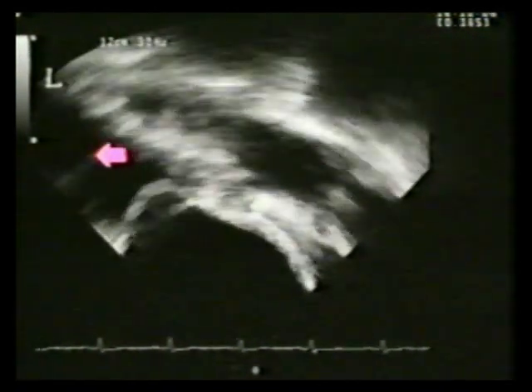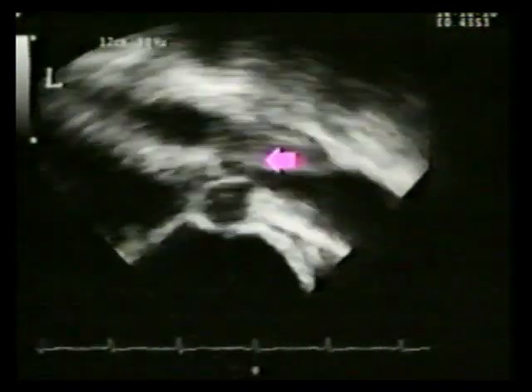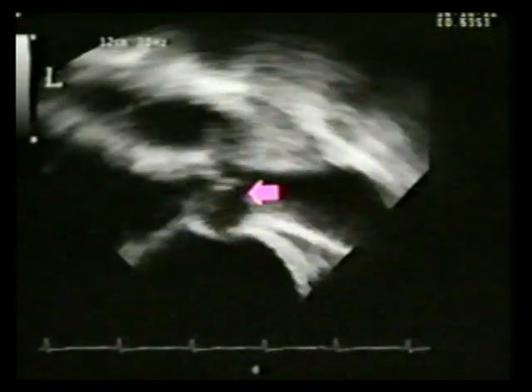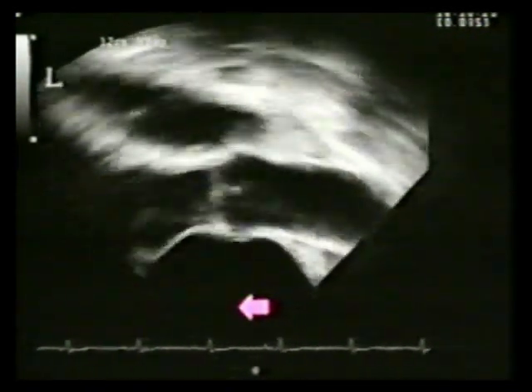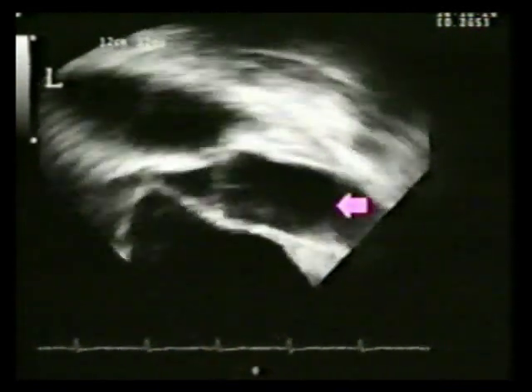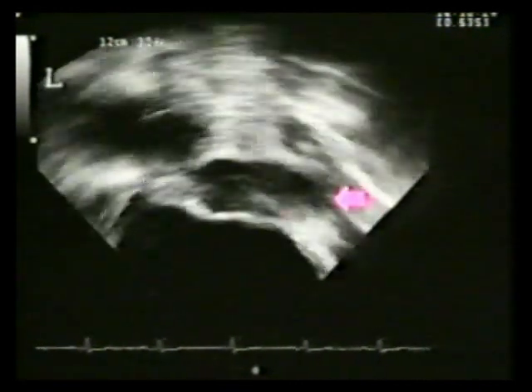Below the mitral leaflets, left ventricle. The ventricular septum separates right and left ventricle and the right ventricular outflow tract. Further rotation results in the long axis of the ascending aorta. This is akin to a parasternal long axis view of the aorta. Posteriorly is the left atrium. Anteriorly, the long axis of the ascending aorta.